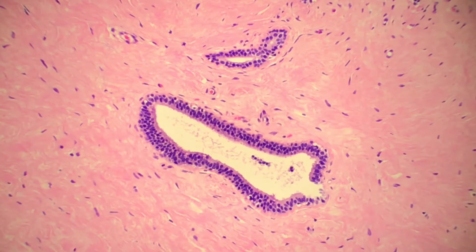So what we notice here is that the stroma kind of forms this cuff, or kind of loops around that central gland, okay? And this is what you want to see, is that it really should be perpendicular to the orientation of the glands. Often these are perpendicular to the basement membrane. I don't think that's necessarily too easy to appreciate in this, since our basement membrane is running essentially parallel with the fibers in a lot of these areas, but that's something that you can see. I think the cuffing maybe is a little easier to appreciate, where it's, again, just kind of going around those glands.